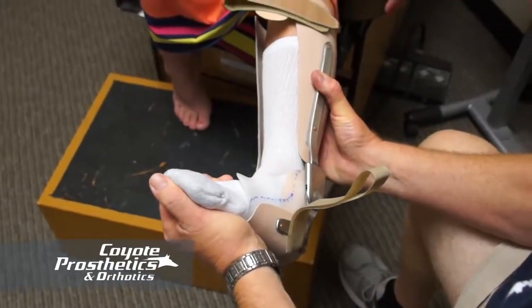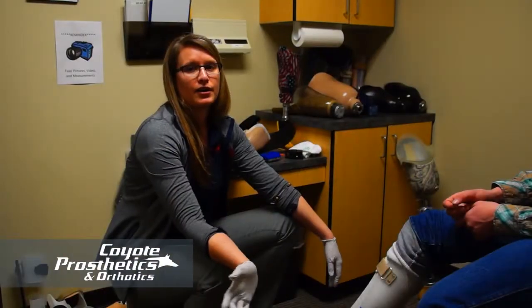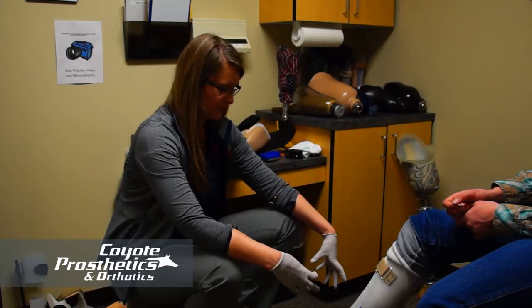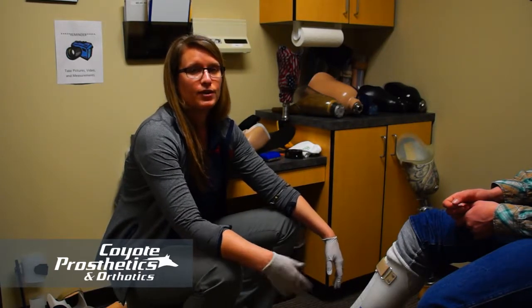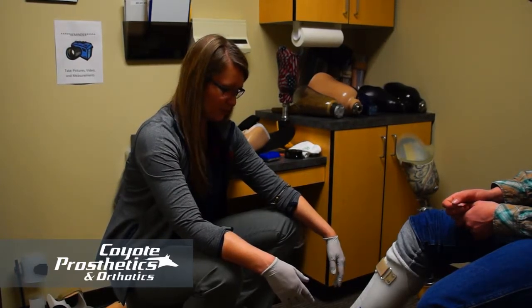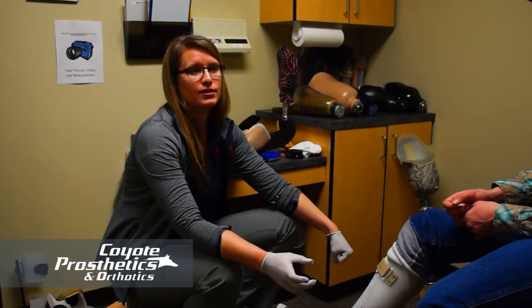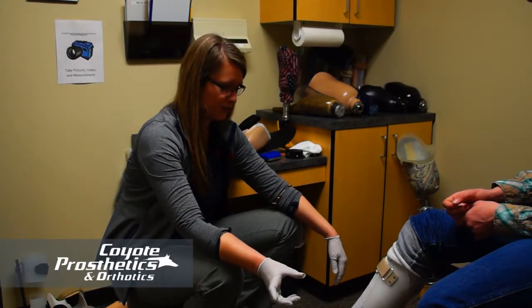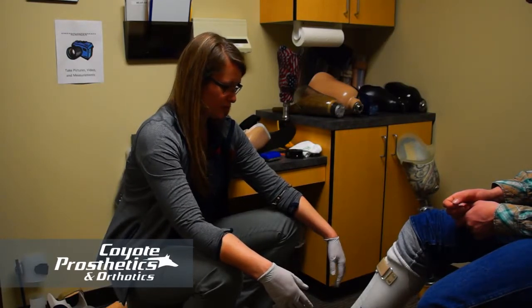Along with the break-in period, you want to check your skin regularly. After wearing it an hour or two, take the brace off, take the sock off, and look at your foot for any areas of redness. If the areas of redness are pink and they fade within twenty minutes, that's not a sign of skin problems. However, if the redness is a really bright angry red, severely uncomfortable, or exceeds twenty minutes after you remove the brace, those are signs you'll want to call your orthotist and get in for an adjustment.